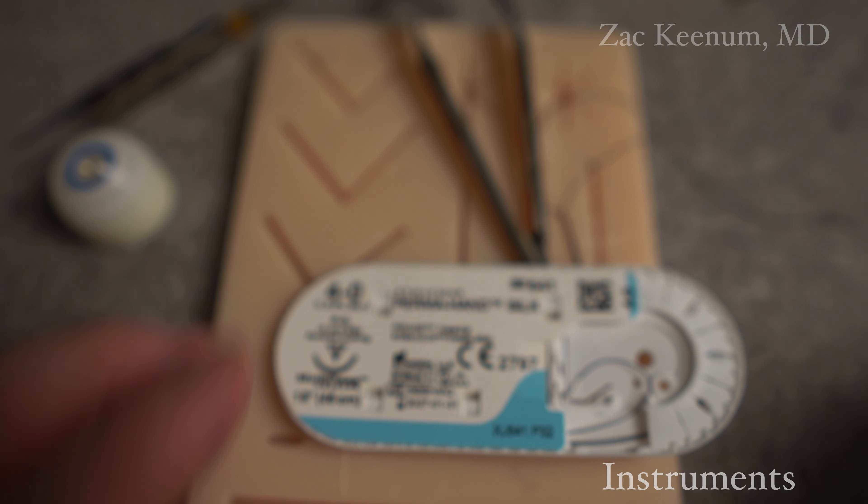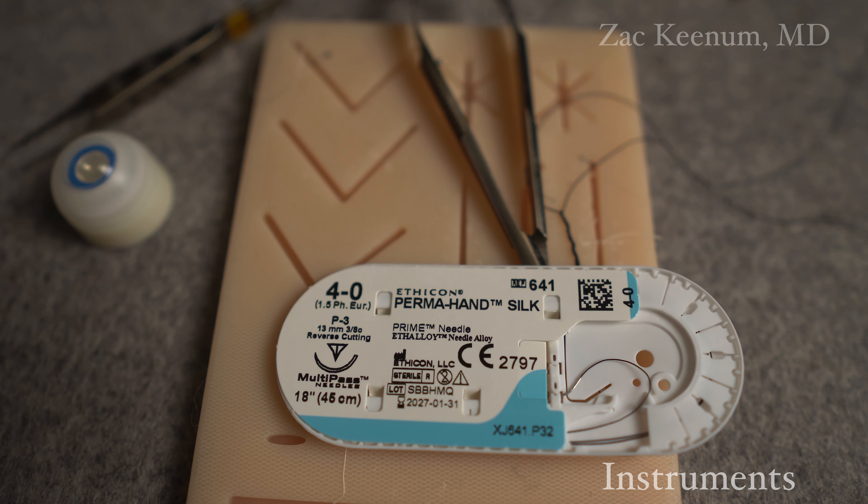Before we get into the suture techniques, we're going to learn simple interrupted suturing, running suturing, vertical mattress, horizontal mattress, and I'll show you a slipknot as well.